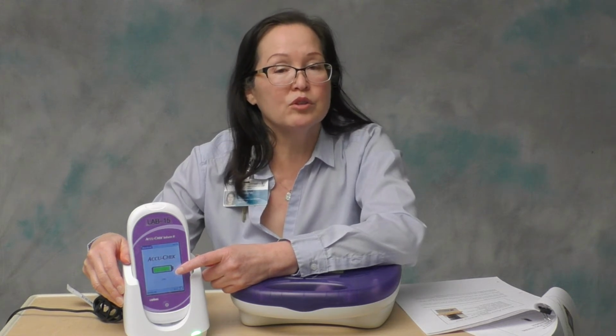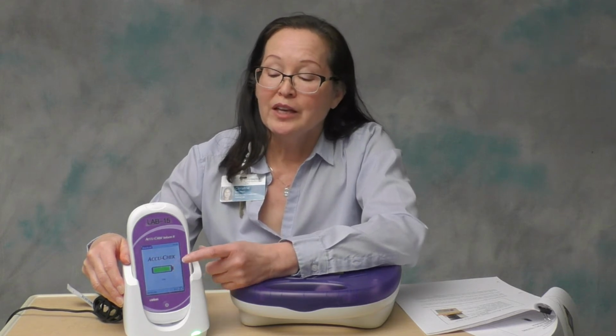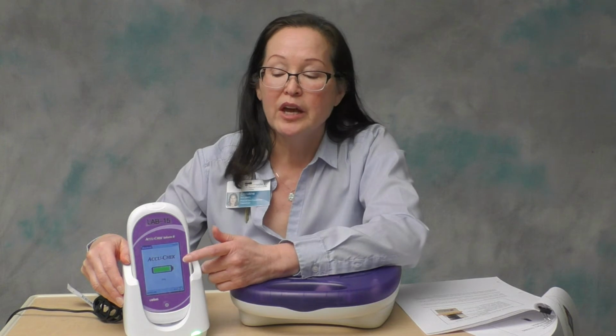Green indicates that there is enough of a charge in the battery that you can run a test, either a QC test or a patient test if needed. If the color of the battery is yellow or red, it indicates that there is not enough of a charge to even run one test. So you could pick it up and turn it on. It might let you scan a couple of things, but then it will shut itself off automatically because there's not enough power to run a test. So if you see the battery icon is yellow or red, you should leave it in the base.